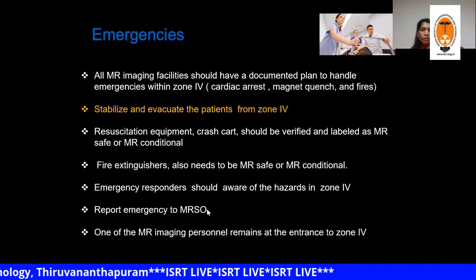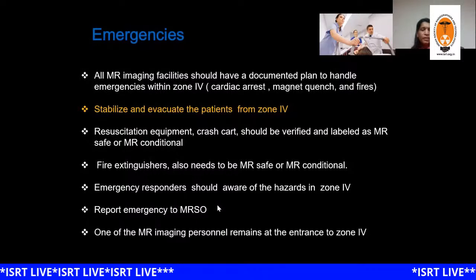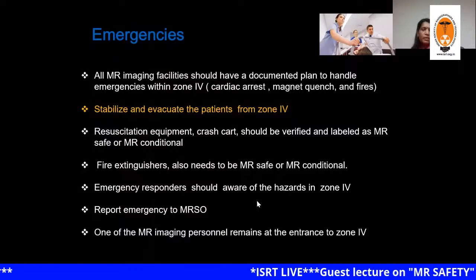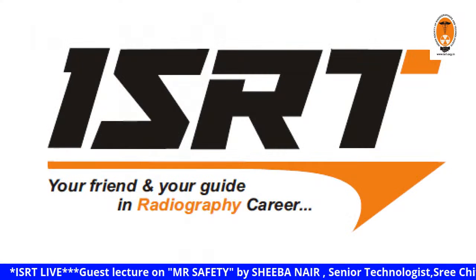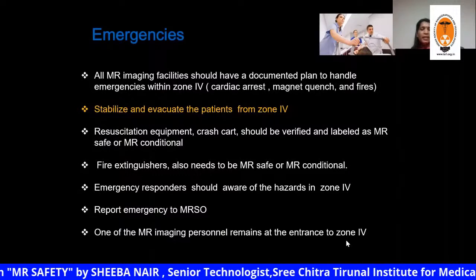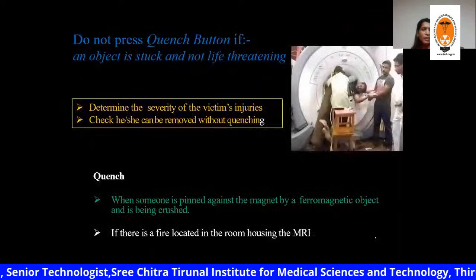Any emergency that occurs should be informed to the MR safety officer first, and he should rush to the area before the other people enter. One of the imaging personnel should remain at the entrance of zone 4 during an emergency management procedure.